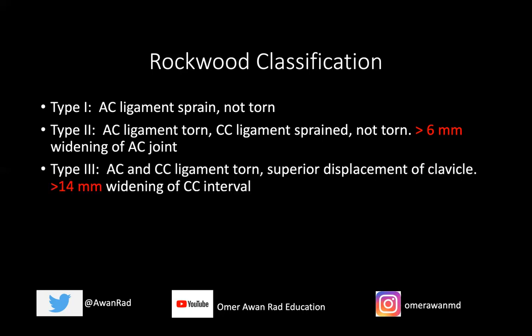A type three, like the case I showed you, is when both the AC and CC ligaments are torn, with superior displacement of the clavicle. The AC interval is typically more than six millimeters and the CC interval — between the coracoid process and the clavicle — is more than 14 millimeters. Most commonly on radiography, you're going to see type two and type three injuries.